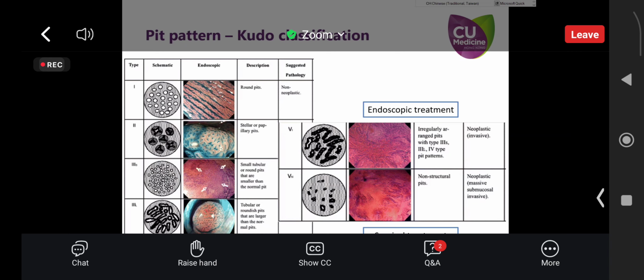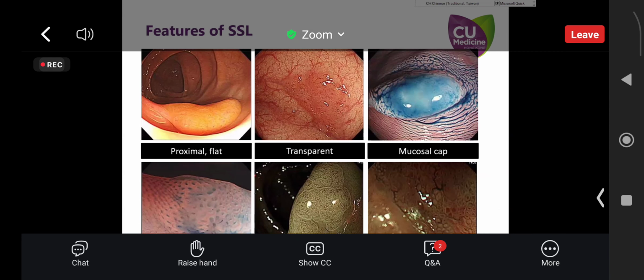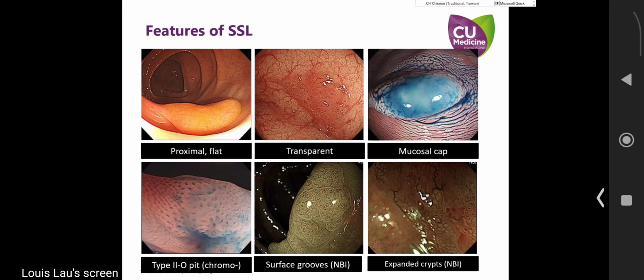So very careful evaluation. And I also want to mention that in the colon there is something quite different. It's called a sessile serrated lesion. Classically it looks pretty similar to a hyperplastic polyp, but it has some individual, classical characteristics that help make a diagnosis of SSL, because this will actually turn into cancer, on the contrary to the hyperplastic polyp.